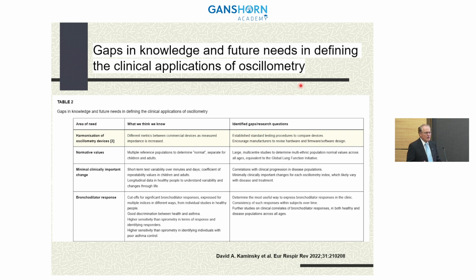In oscillometry, we have multiple frequencies that the manufacturers can use, but essentially we are settling in on reactance and resistance parameters measured at frequencies at 5 and 20 instead of 10, 15, 20, 30, 40, 50, or all the other derivatives that can be done. But there needs to be harmonization across all manufacturers on how that is done.